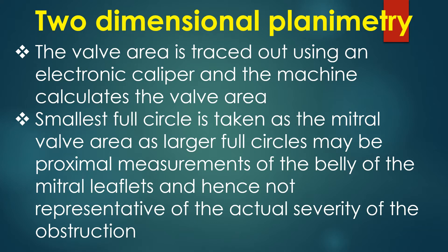In two-dimensional planimetry, the valve area is traced out using an electronic caliper and the machine calculates the valve area. The smallest full circle is taken as the mitral valve area, as larger full circles may be proximal measurements of the belly of the mitral leaflets and hence not representative of the actual severity of obstruction.